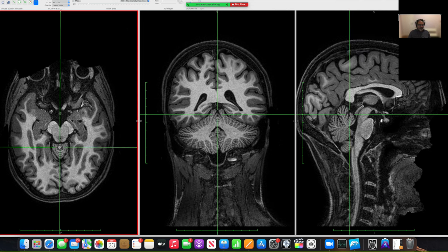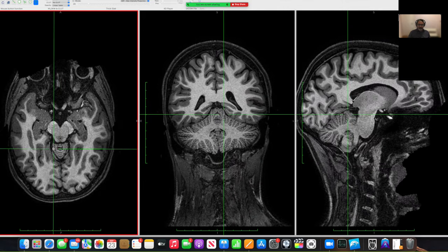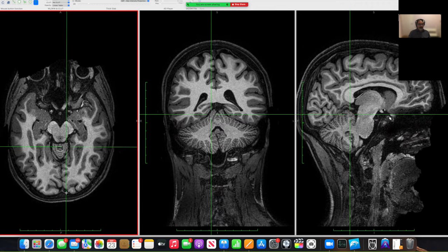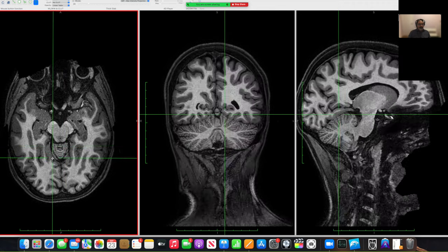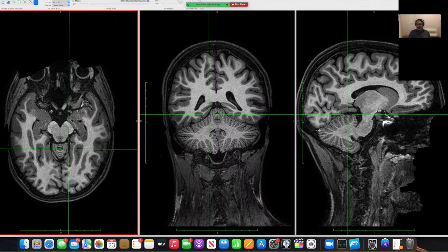So that's what we got. That would be the vermis, and that would be the lobes beginning to start, and that's on the other side. That's great. Keep this place in mind. You see this opening? That's part of the tent. So that's the tentorium. You see that?